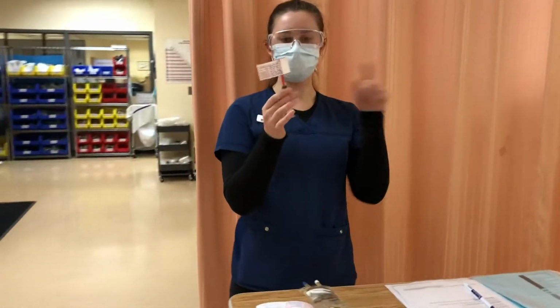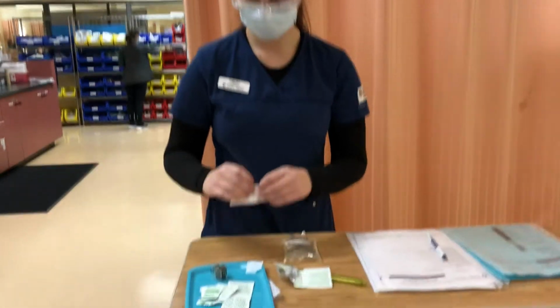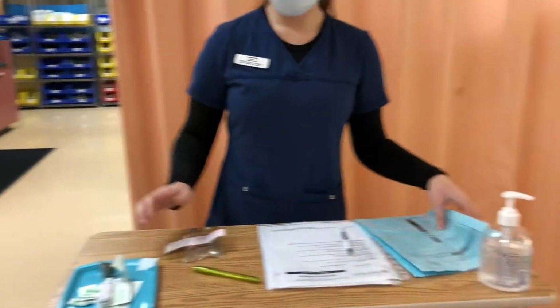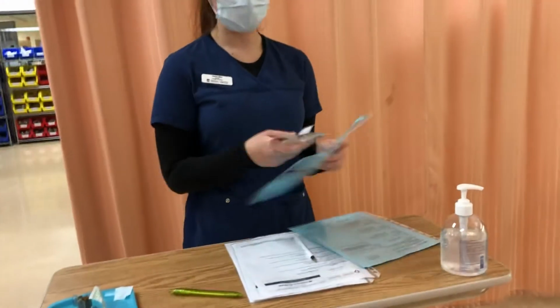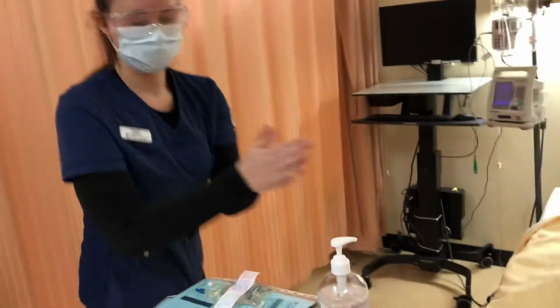This is going to go into the sharps, this is going to go into the garbage, and I'm going to gently roll the medication to make sure it's all evenly distributed. And now I'm going to label it. So now that that is good to go, I'm going to take my MAR, second nurse, and my medication, and I'm going to head to the patient's bedside. Alright, I can also wash my hands.